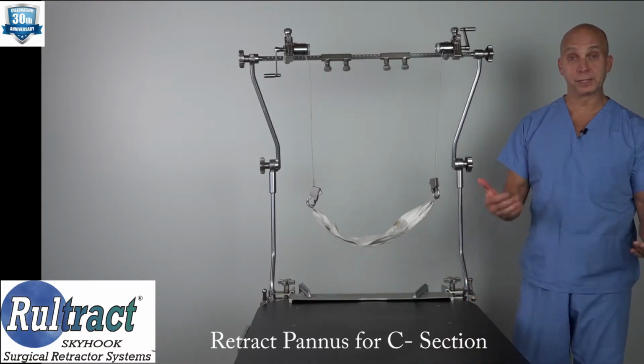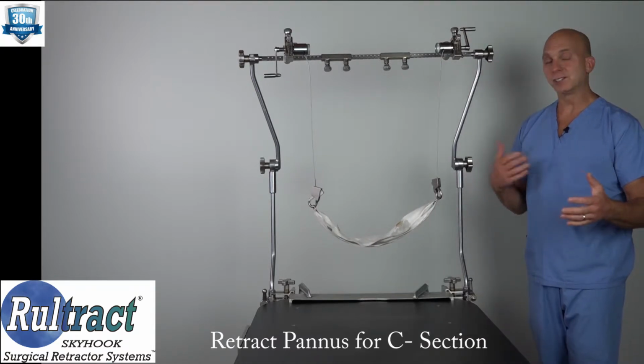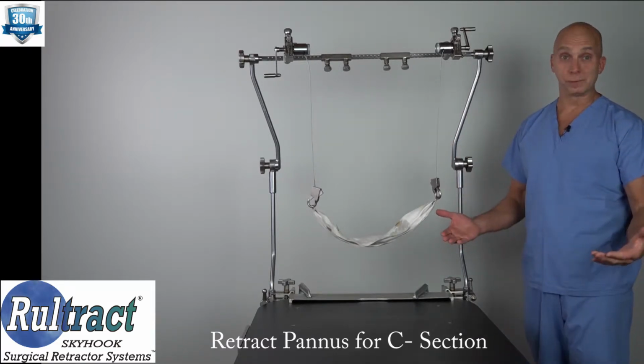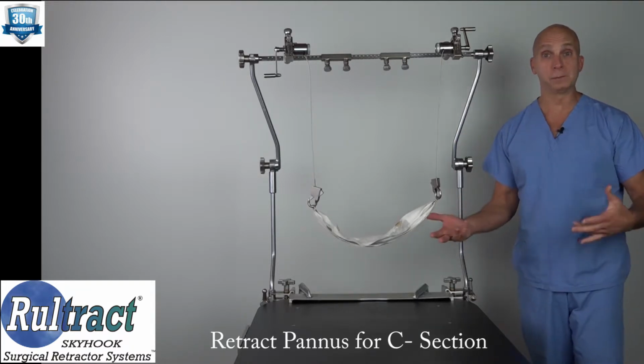Just got off the phone with you regarding retracting the pannus for the C-section. And this is just something that I'd quickly thrown together. Looks a little complicated, and I'm not even sure if it's going to work. But just watch the video if you would, please, and let me know if we're on the same page.